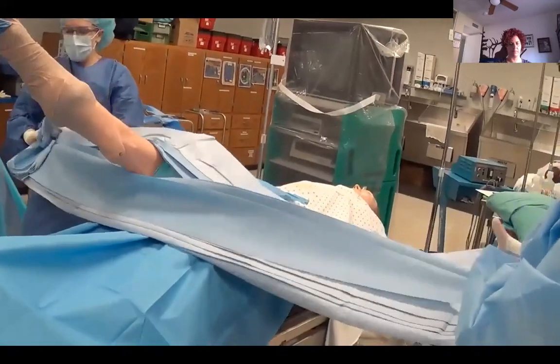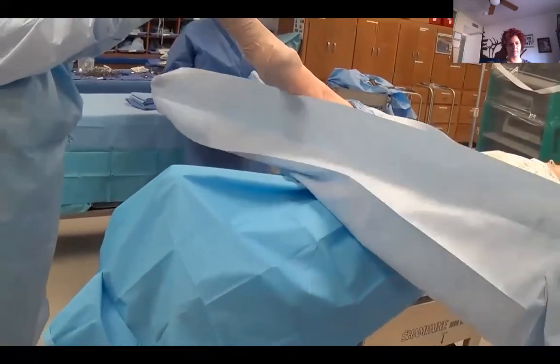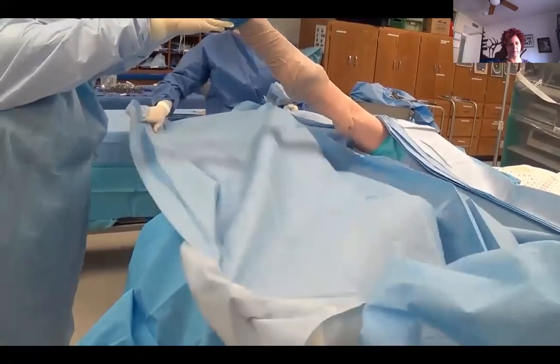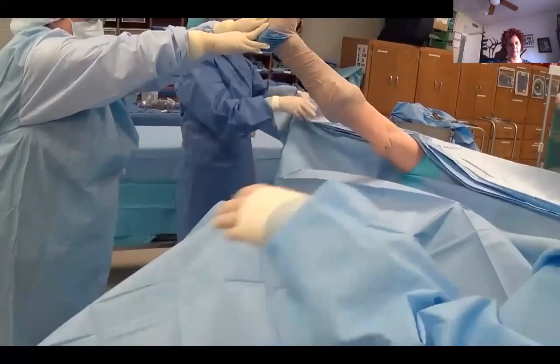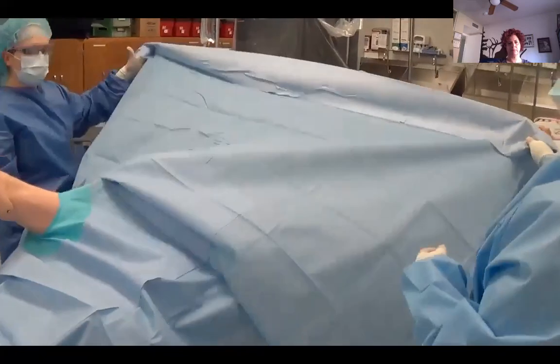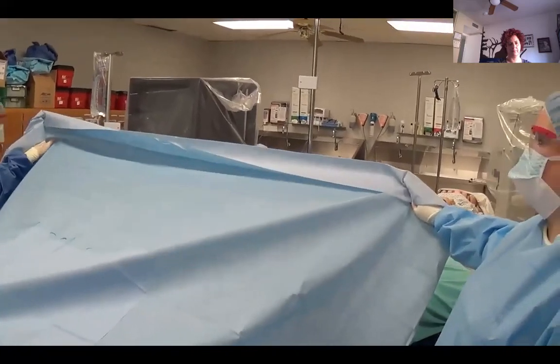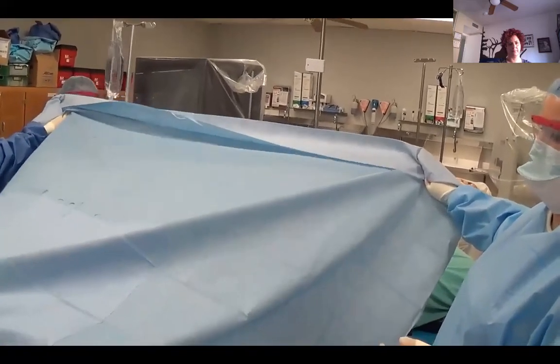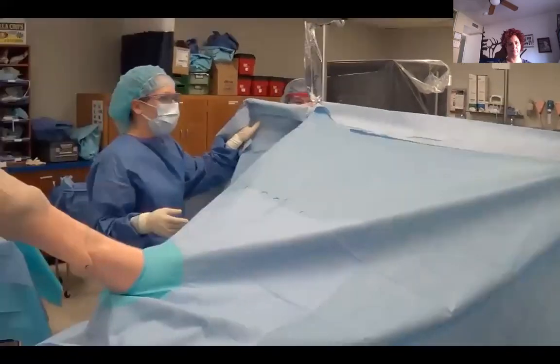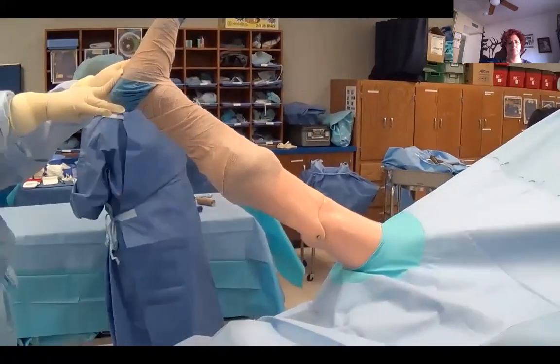And then we keep our hand in there until we get up to the impervious split sheet. And then we open it out, and you're going to open it just like a laparotomy sheet. So grab the bottom section, cuff your hand to the inside, extend out over the foot, and then grab the head, cuff your hand, and extend up to anesthesia, who is then going to attach it to the IV poles. Okay, now these sheets may or may not have armboard covers on them. It just depends on the type of sheet that's being applied.